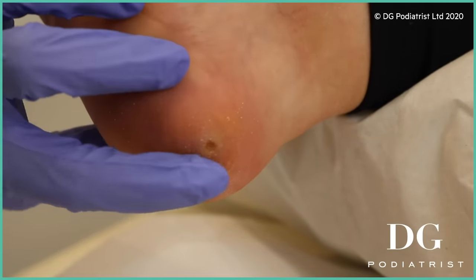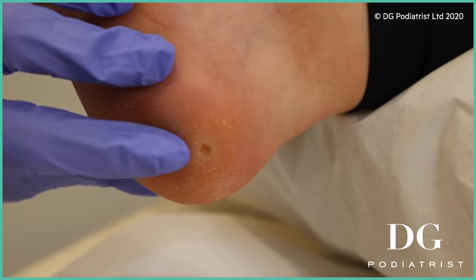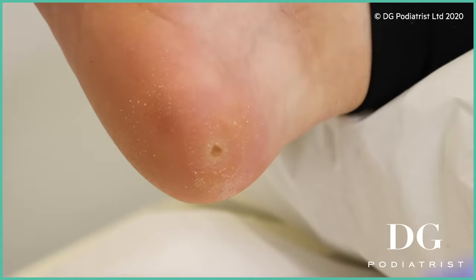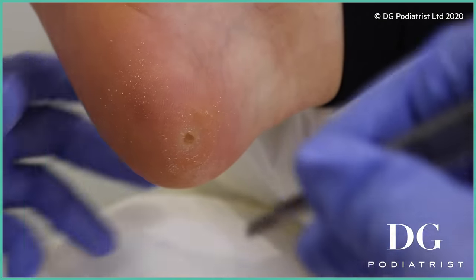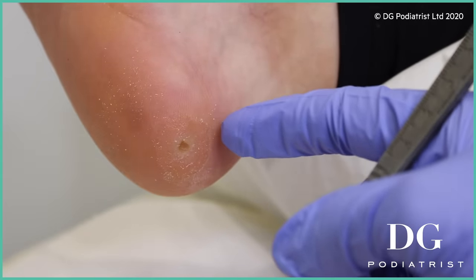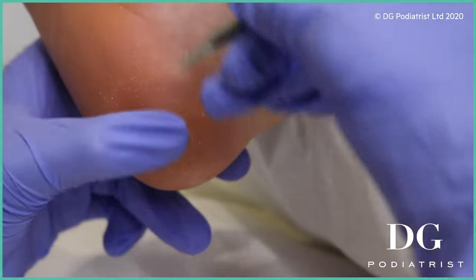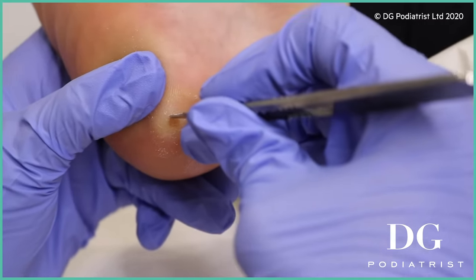So you can see there, just with that deep corner, how large it is on the inside. That crevice that you can see needs to be taken out because I haven't taken that out yet. You'll be able to see this when the video is put through. So now I'm going to take out that center part. When I'm going to take that center part out, let me know how you feel. If it's too sensitive I can always change it for you. Because this is a deep one.